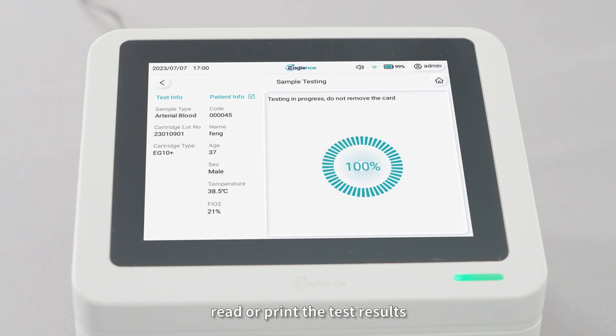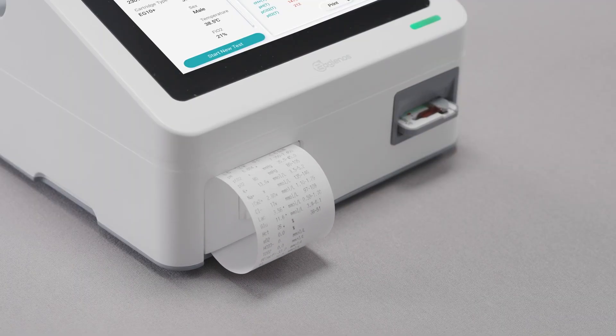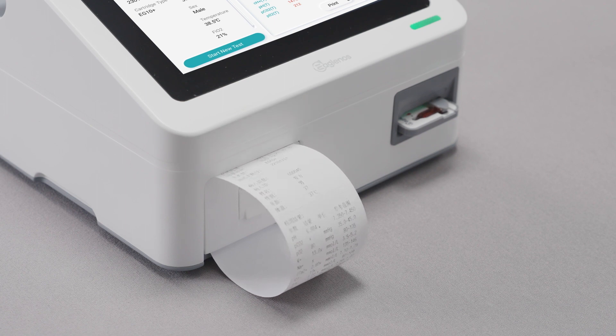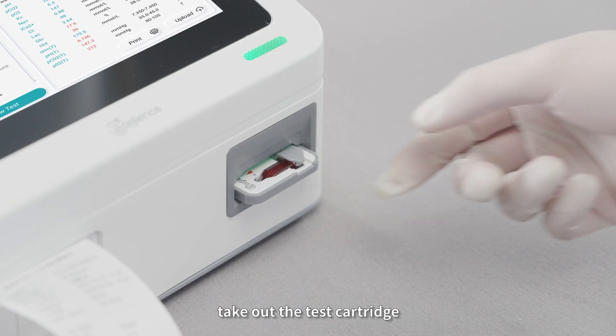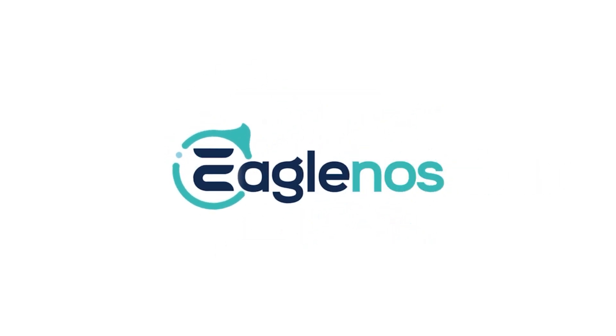Read or print the test results. Take out the test results and remove the test cartridge.